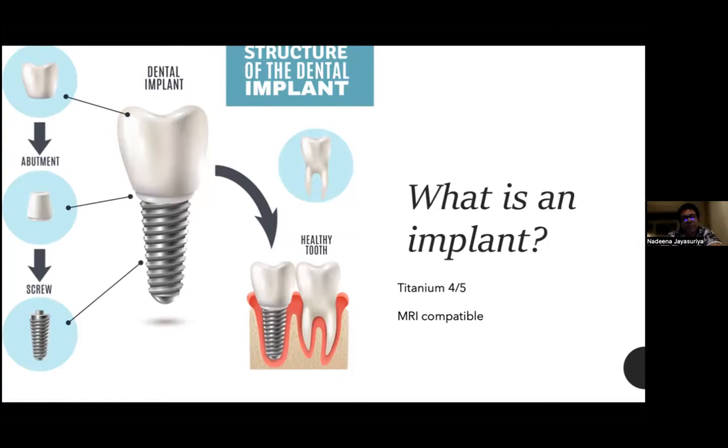So the price of implants, you would have seen that certain implants are very expensive and certain implants are slightly less expensive. That's depending on the grade of titanium as well. That's one factor.